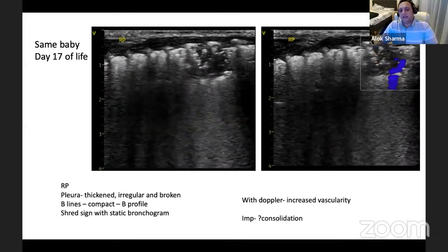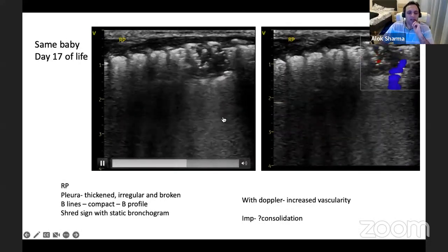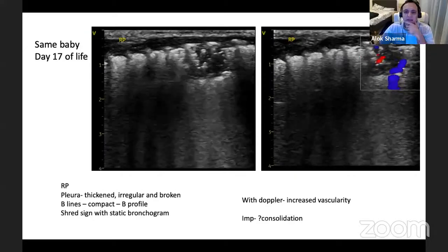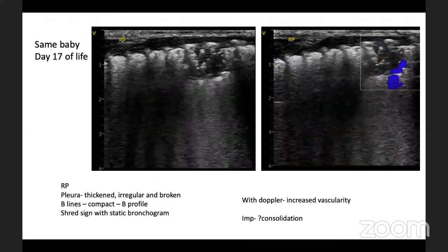Okay, that's great. You have some compact B lines coming through, especially behind the... So, you know, again, it's to say that you can have compact B lines under the area of significant breakdown. Atelectasis. So, do you have any other slides? No, thank you. Okay. Very nice, very good images.